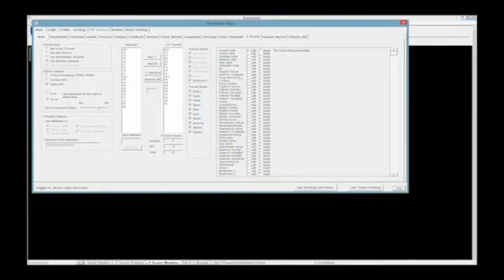Actually, I think that is also going to work. No, it's not. I'm going to talk to them about having specially chosen things to have controls on there.